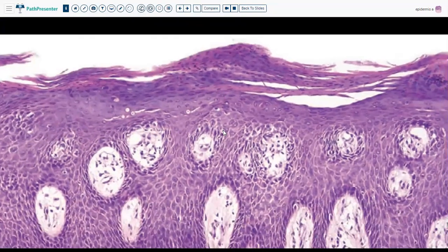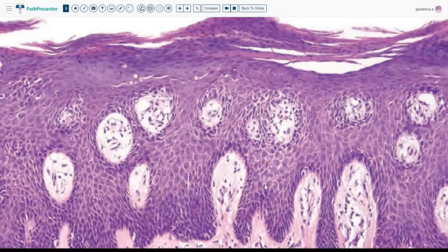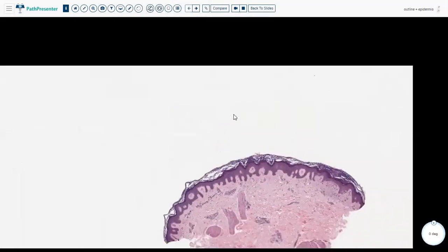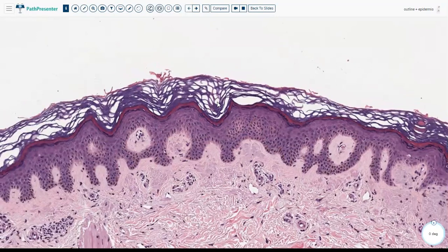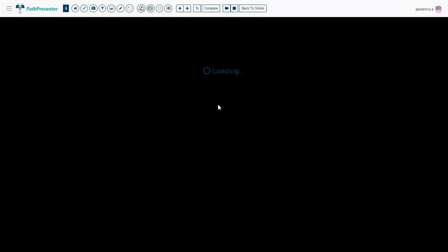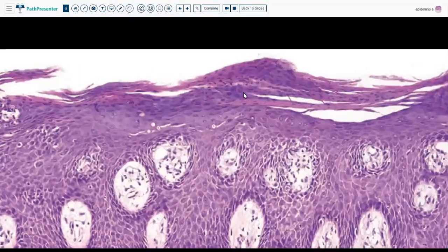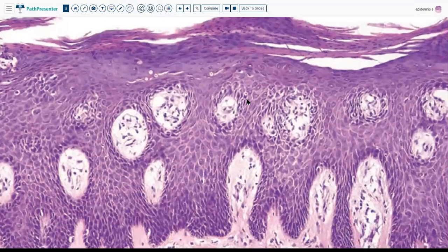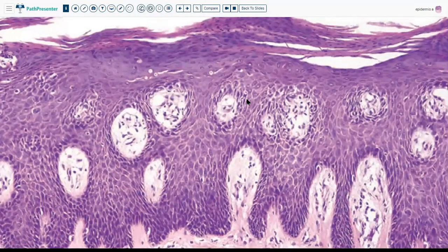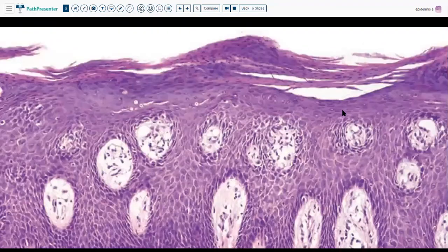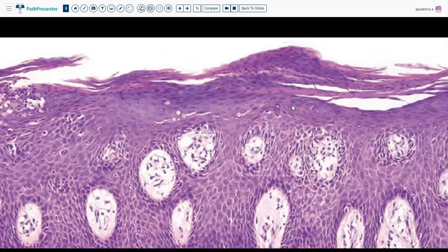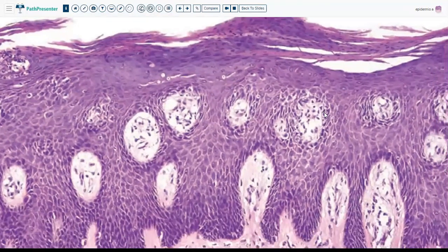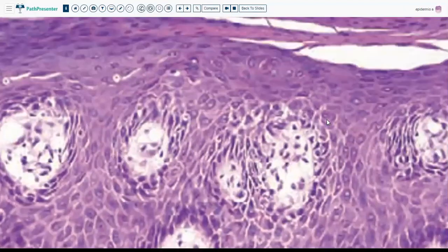This is an example of psoriasis. Why is there parakeratosis? Because normally, skin cells take about 28 days to reach the stratum corneum — by that time, the nucleus has died, so you see anucleated cells. But in psoriasis, the cells reach the top in only five to seven days, so they didn't have time to lose their nuclei. Another noteworthy feature in this slide is the decrease in the granular layer — almost complete absence — what we call hypogranulosis.